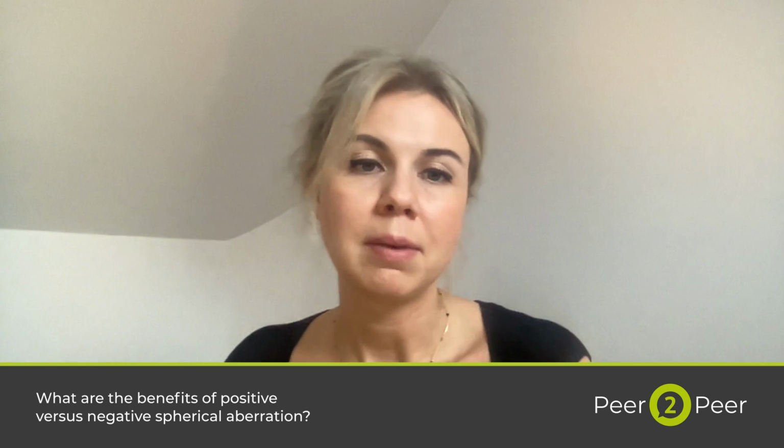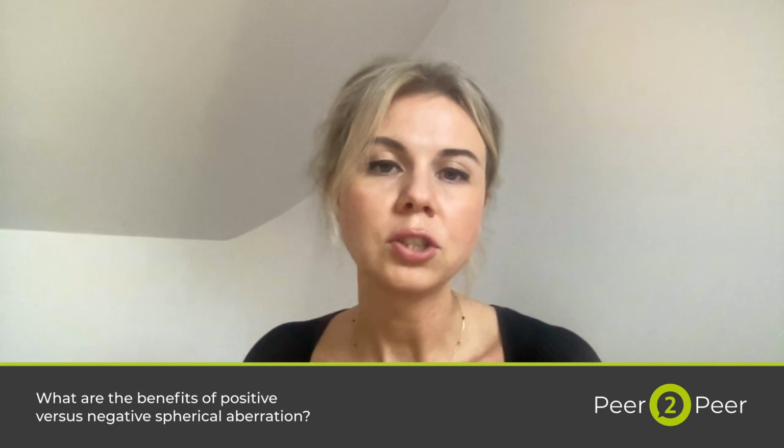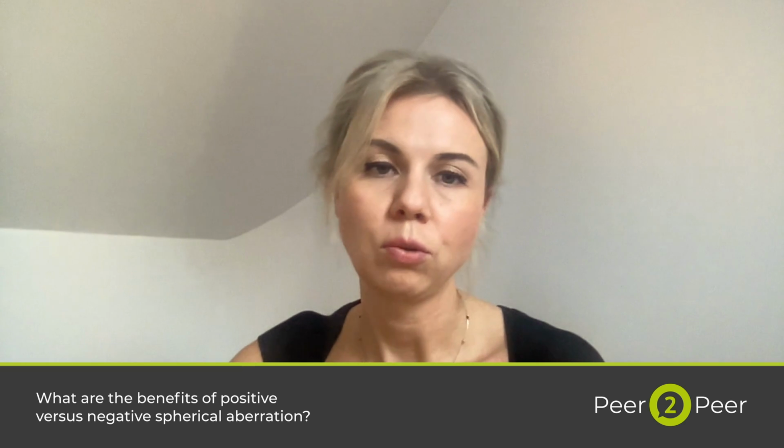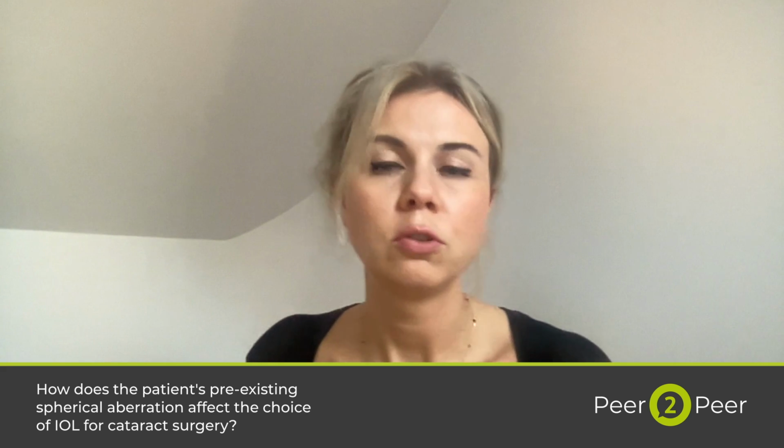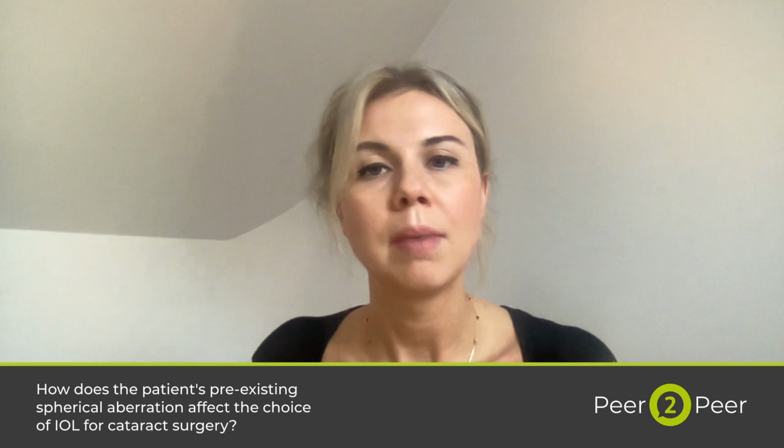And now we also have aspheric IOLs with positive spherical aberration, and here we have the EMV, which induces a small amount of extra positive spherical aberration and increases the depth of focus. Spherical aberration is important when we choose monofocals or monofocal plus lenses. Multifocals or EDOF IOLs are based on different diffractive or refractive mechanisms.